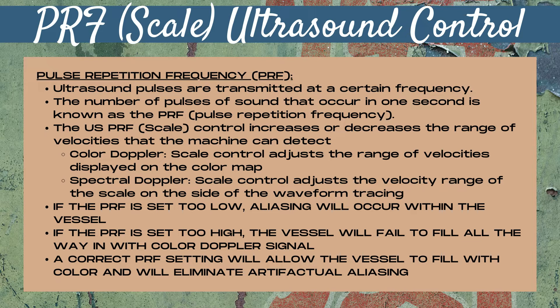With color doppler, the scale control adjusts the range of velocities displayed on the color map. With spectral doppler, the scale control adjusts the velocity range of the scale on the side of the waveform tracing. When the PRF is set too low, aliasing is going to occur within the vessel. On color doppler, this will appear as multiple shades of color within the vessel. With spectral doppler, the signal will wrap around.